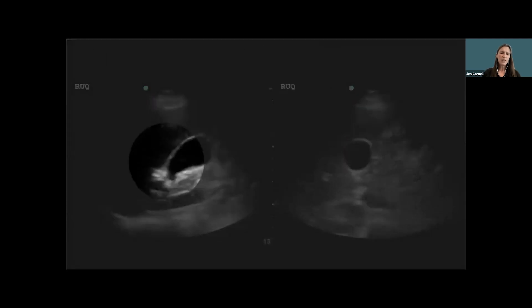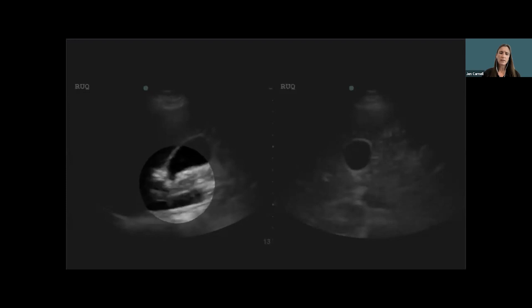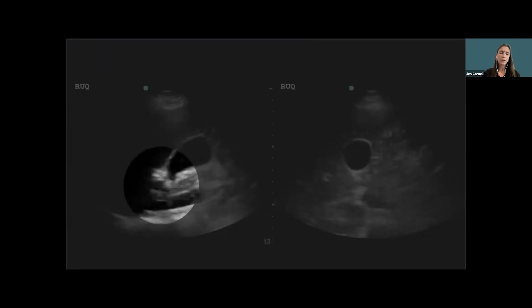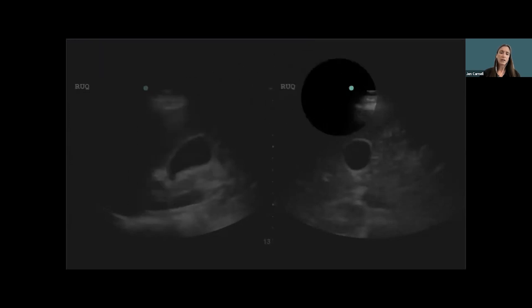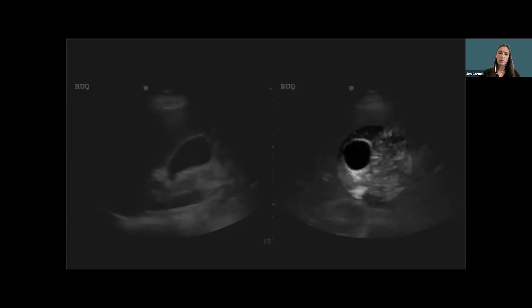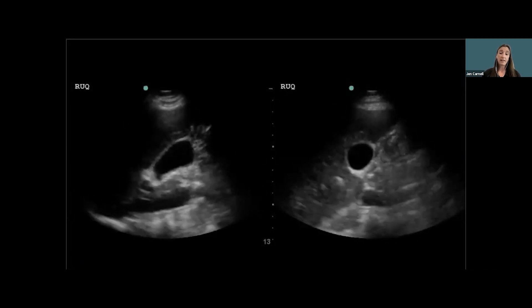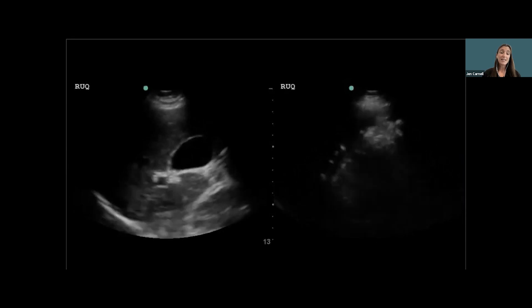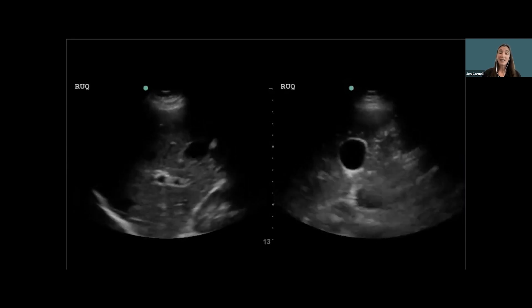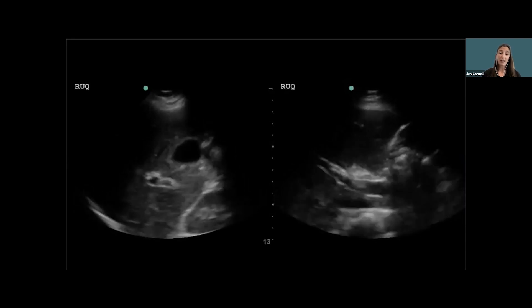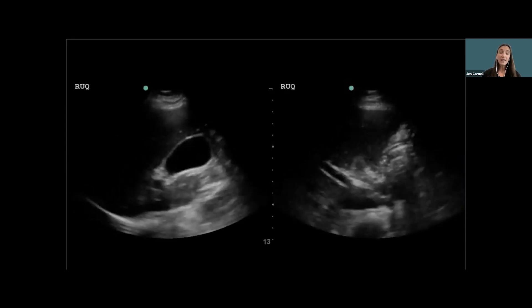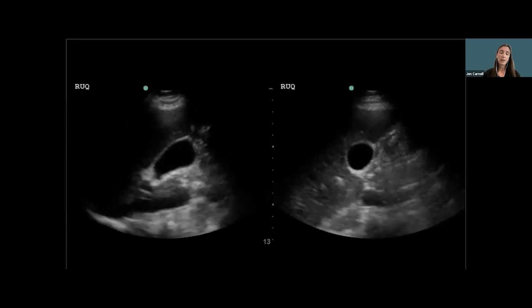I look at this gallbladder and think there's got to be a stone in the neck on the long axis view. I cruise over to the short axis view looking for stones, and I've got nothing. This is a pristine gallbladder — nothing that would explain his right upper quadrant pain.